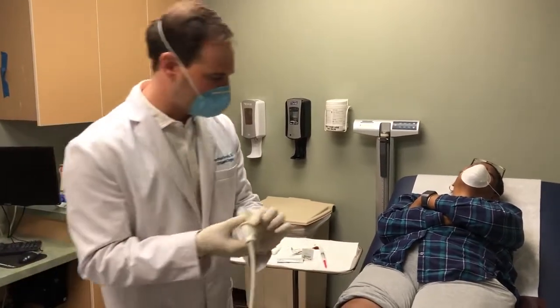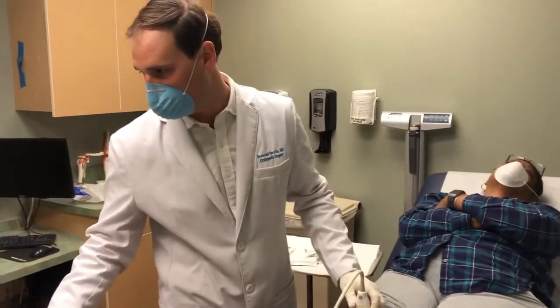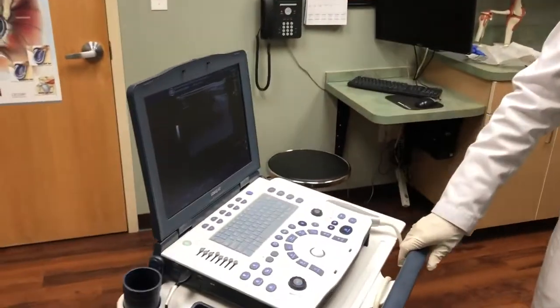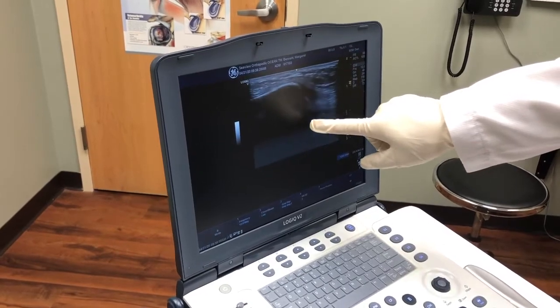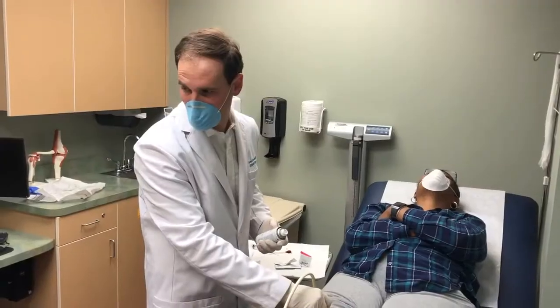We are now going to use the ultrasound machine to better identify where the joint is. You can see here the kneecap and the quad tendon. Our goal is to see the needle just under the kneecap and quad tendon so that we know we're in the joint.